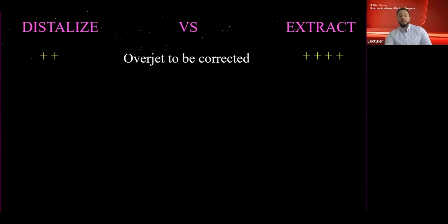First, we need to evaluate, diagnose and assess the cases in the 3 dimensions of malocclusion: sagittally, transversely, and vertically. First, the sagittal relationship, in terms of the overjet to be corrected. We know that aligners can treat Class 2 malocclusions, and that distalization is one of the most predictable movements to be achieved, but it also has a limit. If the overjet of the patient is extremely severe, we should consider extraction for those cases, while for around 3 to 4 millimeters, we can consider the distalization option.